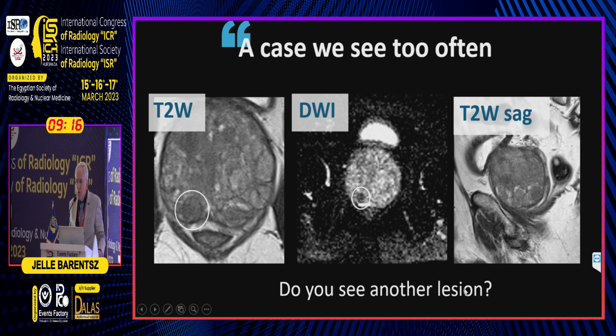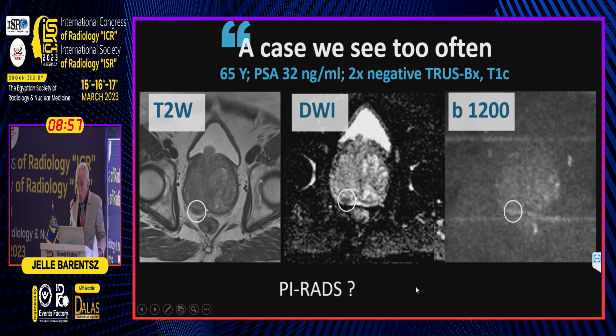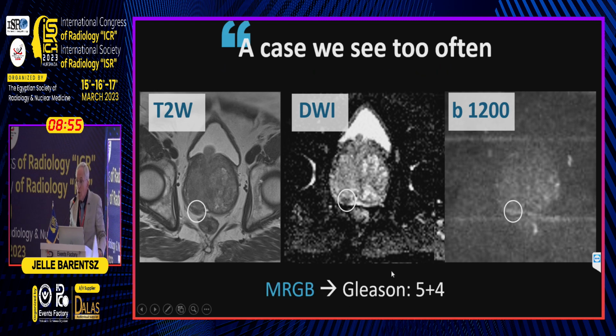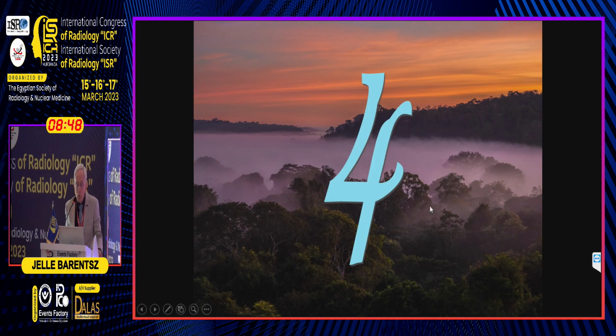Second of all, there's another lesion. Do you see it? Well, look at all the images, and if you look very closely, you can see something over here. And if we now go to the slice of the other images, you see that there is a small lesion here, which is dark, slightly bright, and also focal, so PI-RADS is either a 3 or a 4. Biopsy showed a very aggressive tumor. So urologists are not happy. We should work on that.